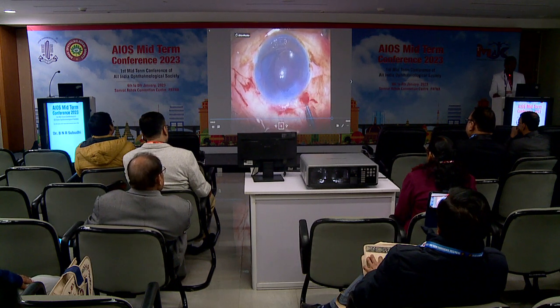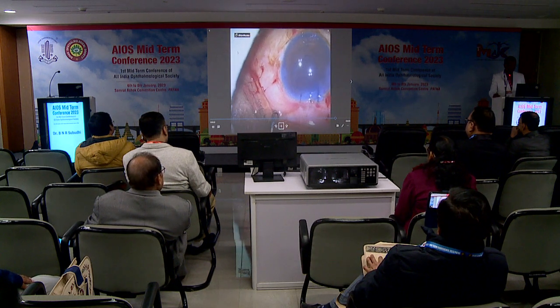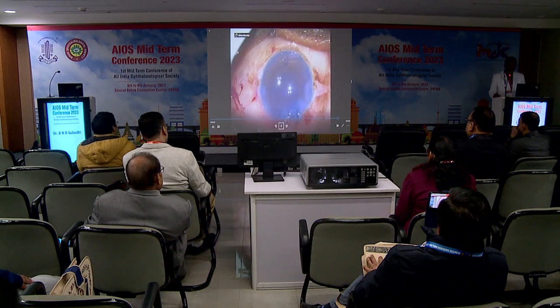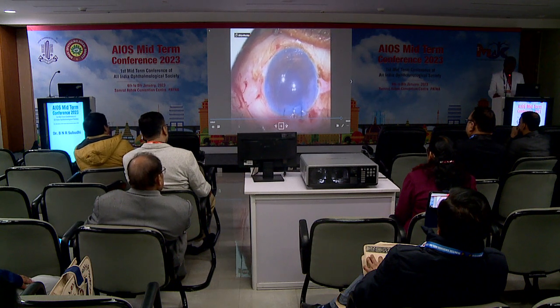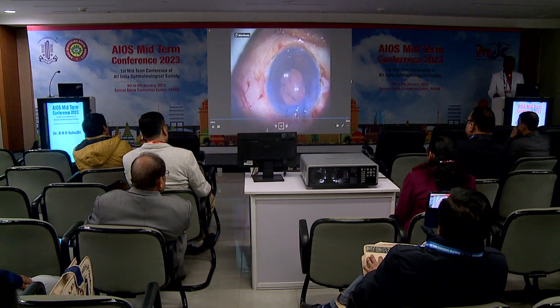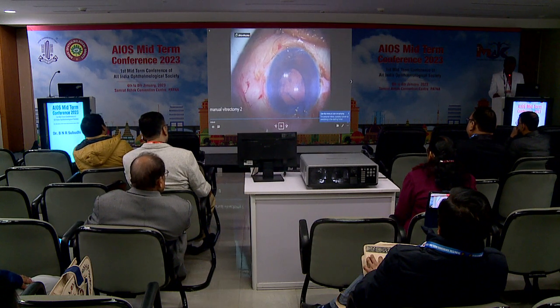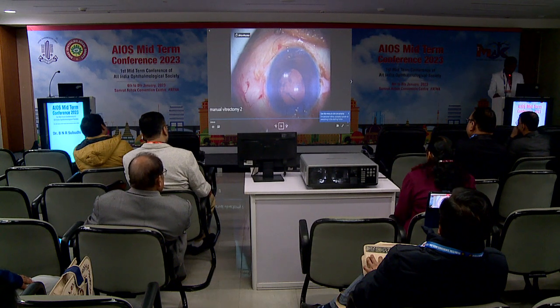Then place the IOL carefully without disturbing, and we have seen in many cases the IOL remains in place quite satisfactorily.